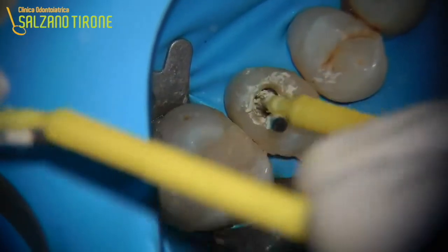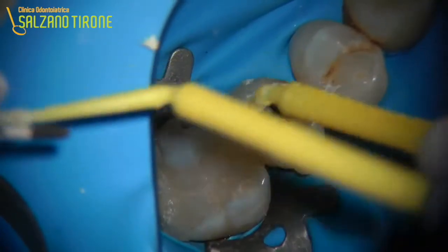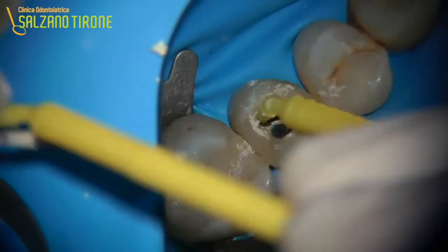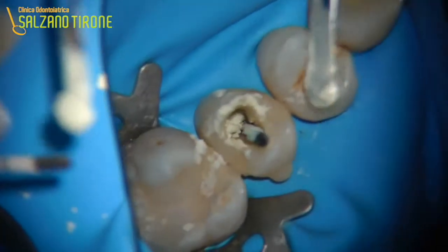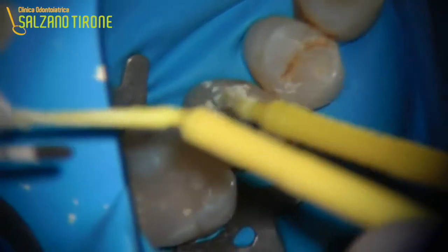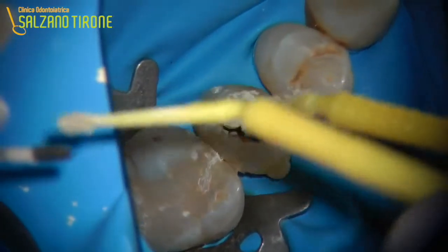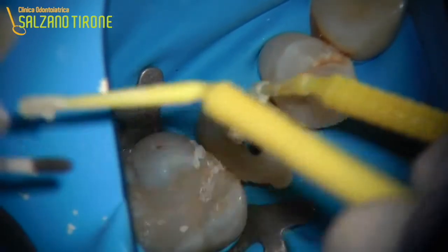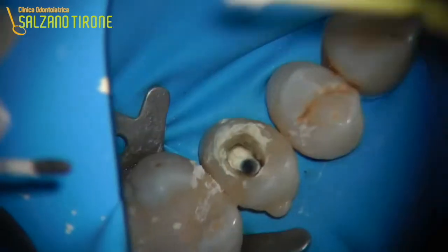Then, as we know, the MTA needs to be in wet environment for 24 hours to harden at its best. So at the end of this procedure, we will cut and remove the paper cone that we had put as soon as the MTA started becoming solid. We made it well compact, so take a paper cone, moisten it with physiological saline, clip it and put it inside the cavity, then put the usual wet cotton pellet, put some cavity paste on it and check on the patient 24 hours later, because we know that is the best moment to get the best physical mechanical characteristics of MTA.